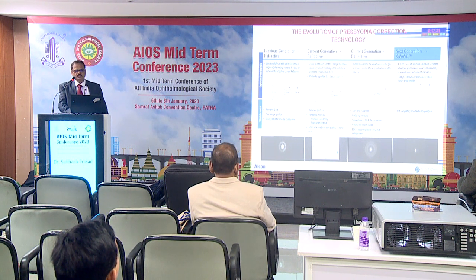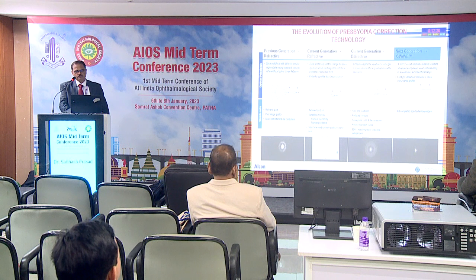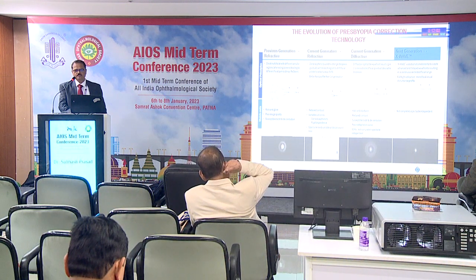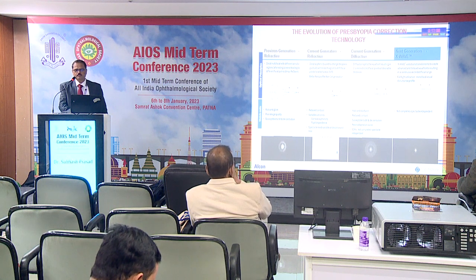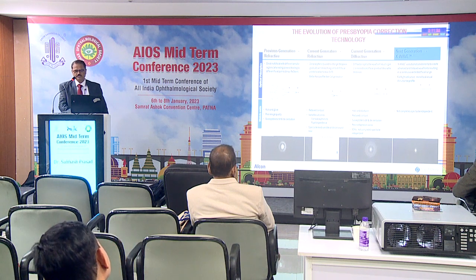But the most popular was the diffractive type of IOL, where diffraction splits the wavefront, resulting in 2 or more distinct focal points at desirable distances. But these lenses are also not without visual disturbances in the form of halos or starbursts, reduced contrast, and so many things. So there was always an unmet need for a lens which can reduce dependency on glasses, but at the same time offer good quality of vision. In that respect, I think the EDOF lenses started scoring better than the other lenses.